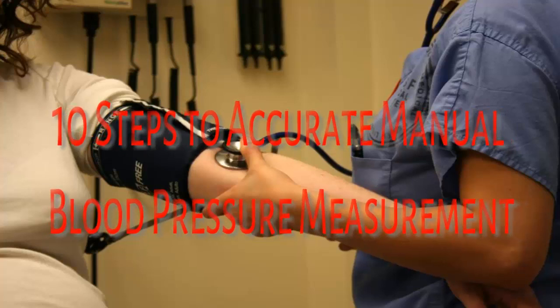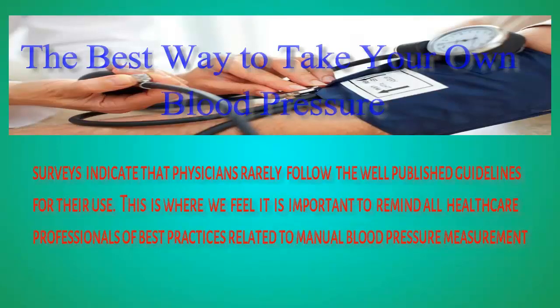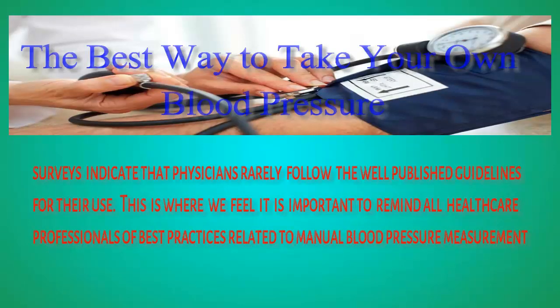10 Steps to Accurate Manual Blood Pressure Measurement. Surveys indicate that physicians rarely follow the well-published guidelines for their use. This is where we feel it is important to remind all healthcare professionals of best practices related to manual blood pressure measurement.